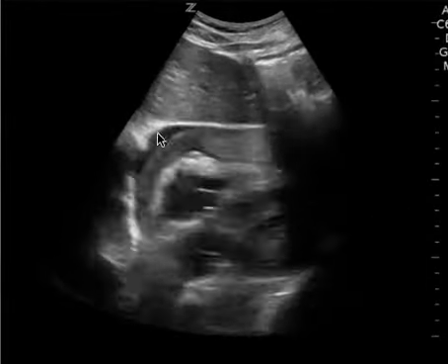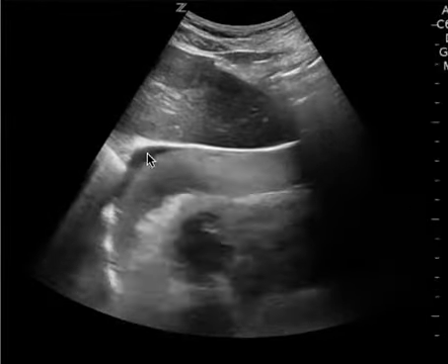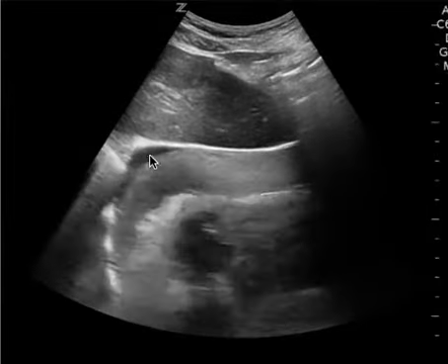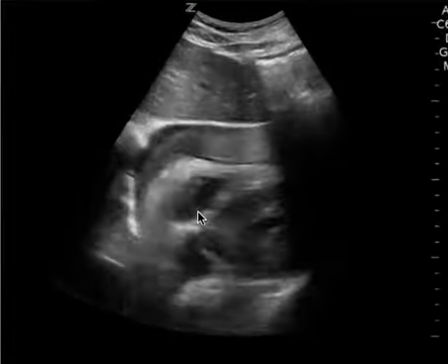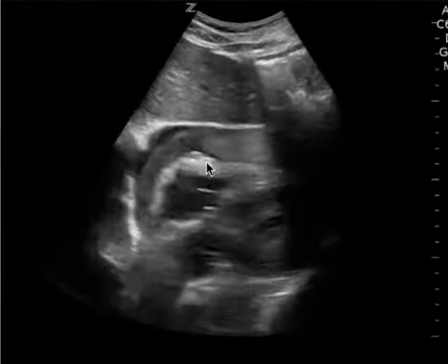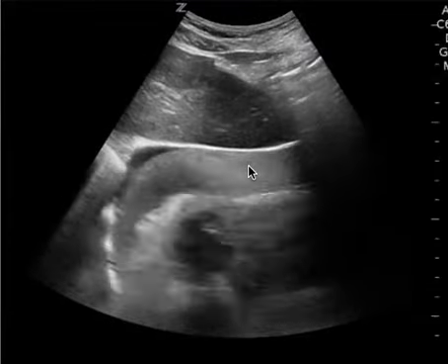You can see this small area of hypoechoic or blackness, and that looks to me to be fresh blood — it's the same color that's in the right atrium here. But this gray or heterogeneous finding here, to me, is more blood clot.